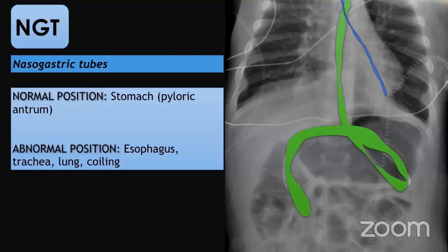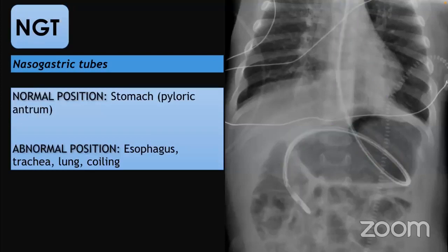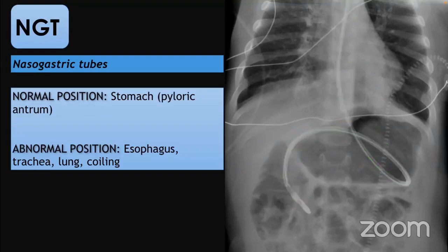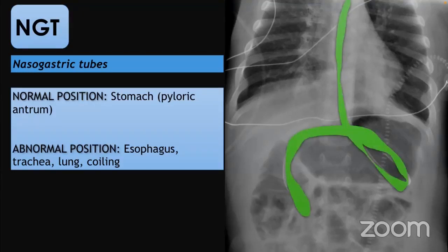And in the image here, we have the nasogastric tube, which is malpositioned in the left bronchus by the blue line here, which is malpositioned. This one is the nasojejunal tube, and the blue one is the nasogastric tube, which is malpositioned.